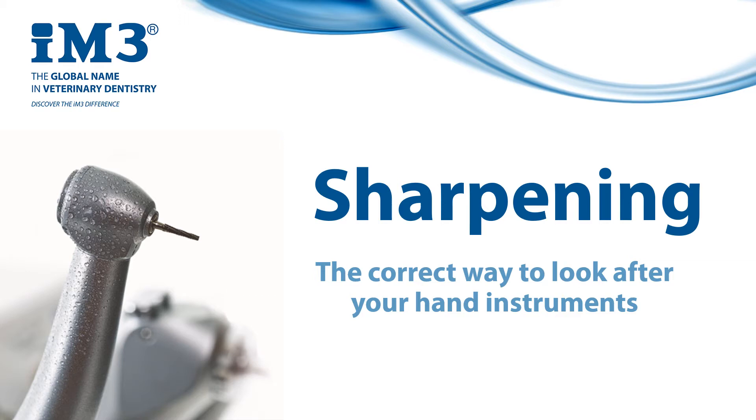Hello, my name is John Breen and welcome to this tutorial on sharpening. Sharpening is essential maintenance for your dental instruments, and no dental kit is complete without a sharpening stone for that reason. The techniques are simple and only require minor tweaks depending on the instrument you intend to sharpen.